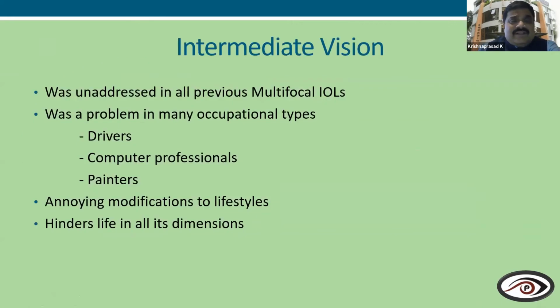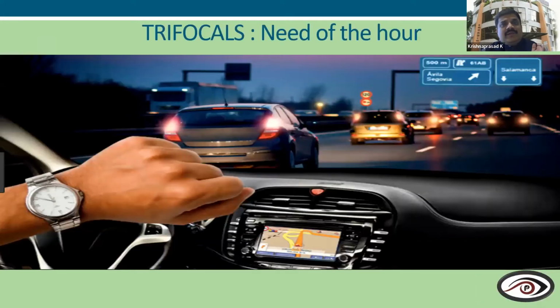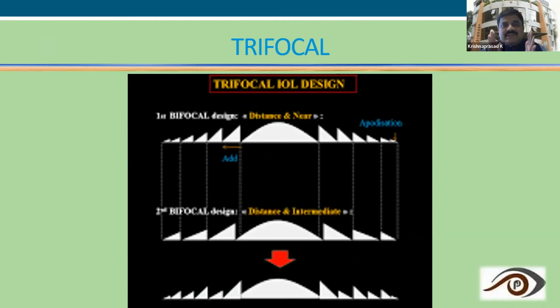Very important about the intermediate vision, because most of the professionals now mainly depend upon intermediate vision, especially drivers and computer professionals. If you implant them a multifocal intraocular lens, I think they have to really change their lifestyle. This is where the trifocals come into play. Of course, basically this design is a mix and match of both the first generation bifocals and the second generation bifocals.